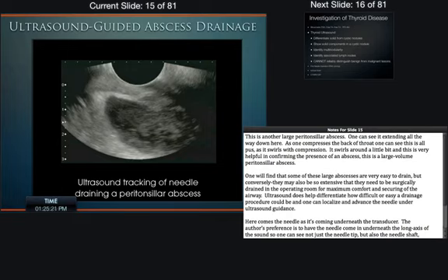And we do that on the skin a lot in soft tissue abscesses. You're going to learn a lot about that next year, but this is just an example of all this pus kind of swirling in the back of the throat in a very large peritonsillar abscess. Pretty easy to drain. You just need to incise through this area, and you'll see all the pus start to drain out.